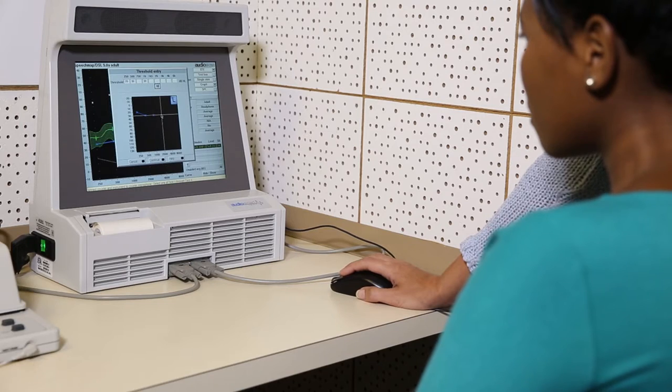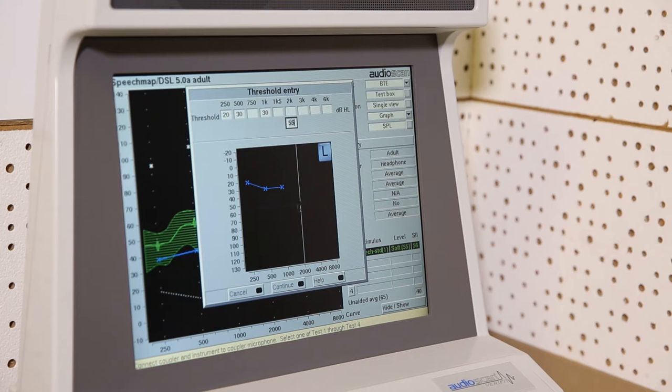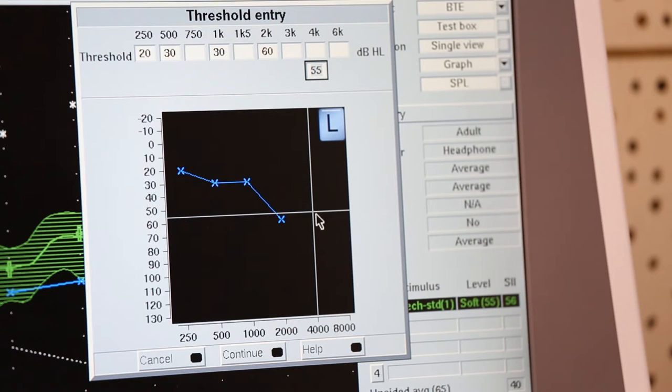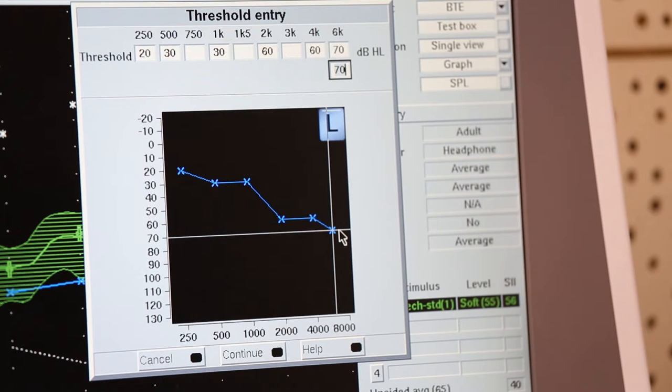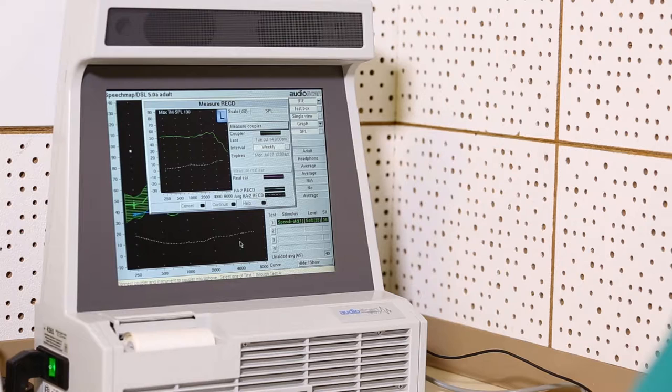The first step is to simply put in your hearing thresholds. You then press continue. And then we need to complete our RECD test that will create a target based on the real ear resonance characteristics instead of those of a 2cc coupler.